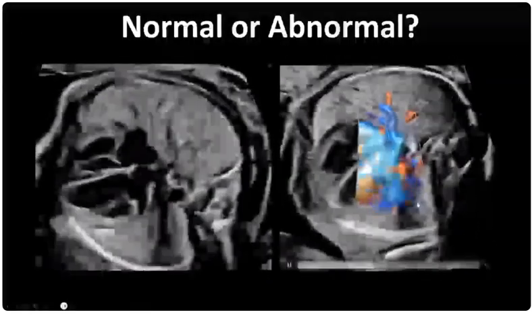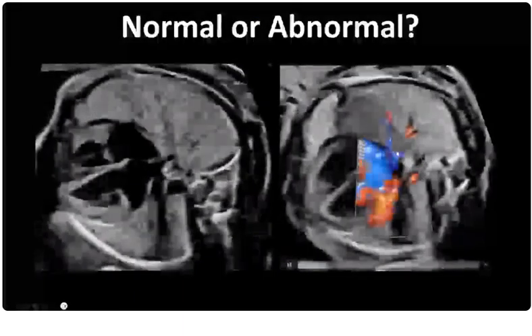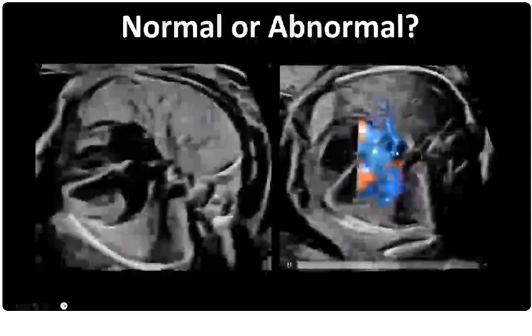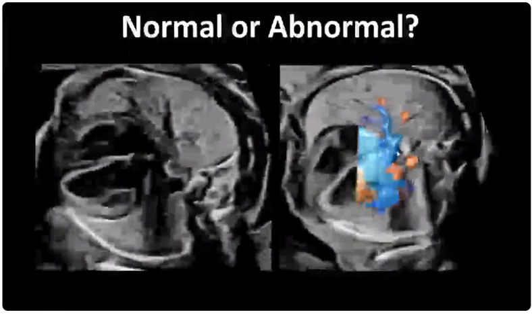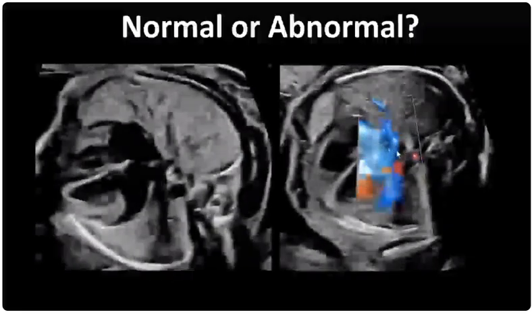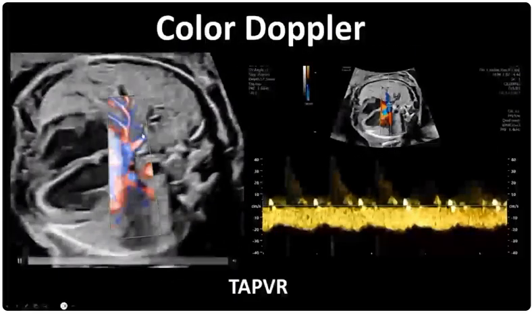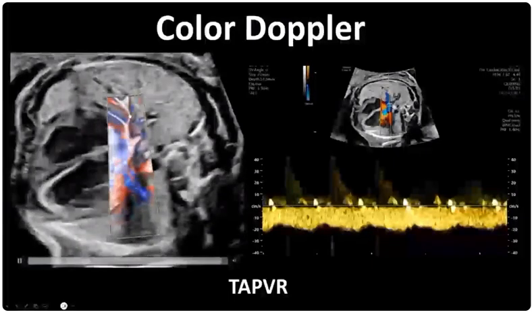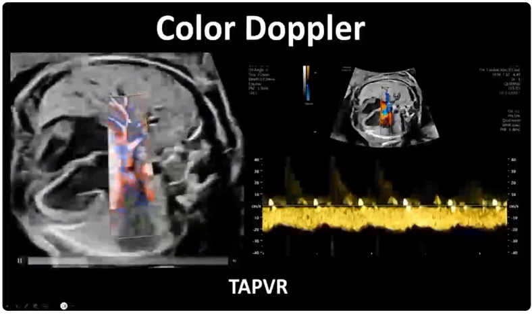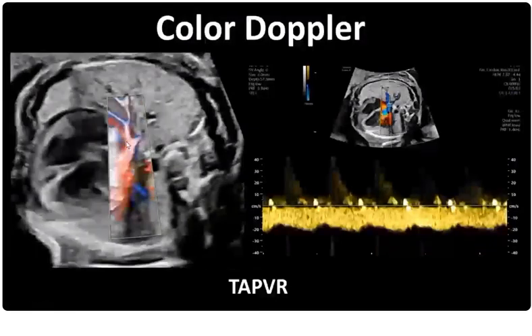But if you look at this example, we have the 2D image and the color Doppler. This is the screening exam. Can we tell for sure if it's normal or abnormal? This is where the role of the spectral Doppler comes in, because this fetus presented for echocardiogram, so we followed the guideline and assessed the pulmonary veins not just in color but using the spectral Doppler.